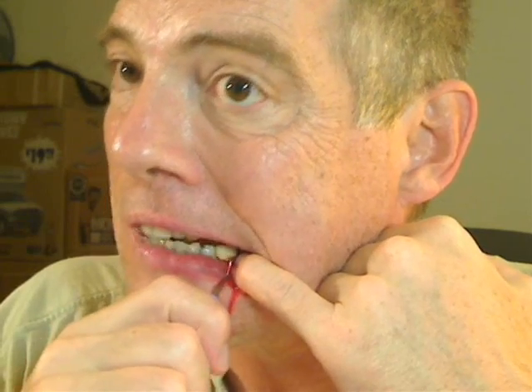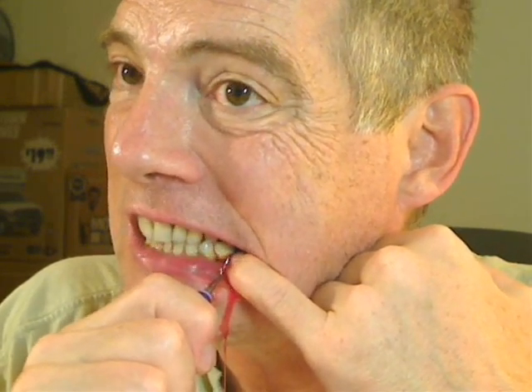Is there a possibility it was bone? No. And how do I know it's not bone? Well, I'm coming from the tooth. I'm coming from the tooth. I can also attempt to go around this corner. Let's say for argument's sake that this was bone — which it's not — but let's say it was. And then, to keep the tooth, I had to sacrifice a small piece of bone. Would that be a worthwhile sacrifice? I would say yes. A little piece of bone, you're never even going to see.